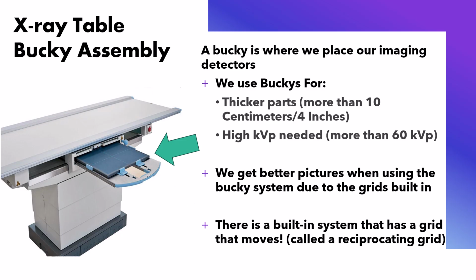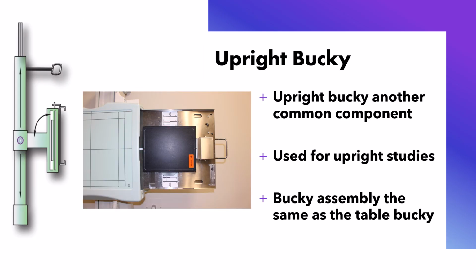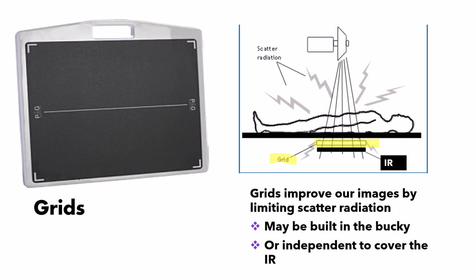That's called a reciprocating grid. The upright Bucky is just like the table Bucky, except it is turned in that upright position. Here, it's standing up instead of lying down. The patient stands up, but all the components are the same.